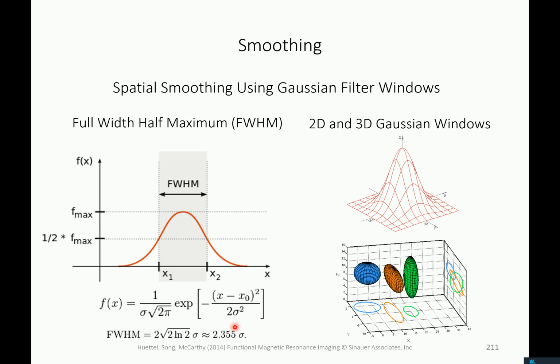For good mathematical reasons, these functions are the Gaussian probability density functions, but they are not acting here as probability distributions. So they are not distributions. They are just the kernels of the filter. So you weight the data that you have by these numbers, and then you can of course increase or decrease the full width half maximum, because this is a parameter of your filtering algorithm.